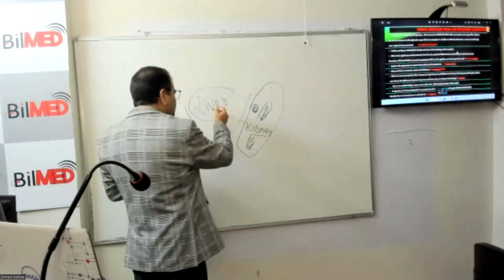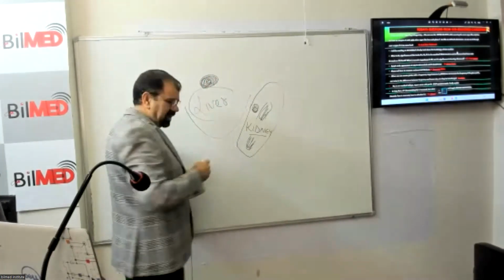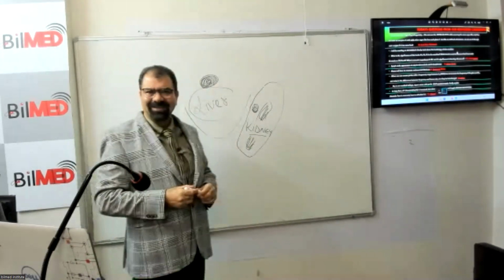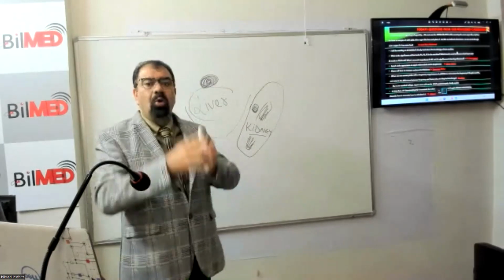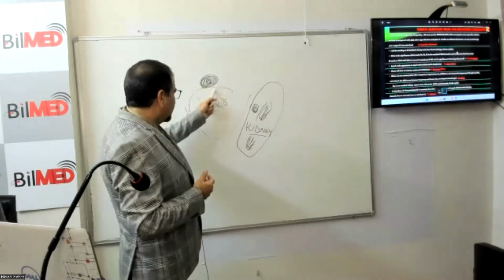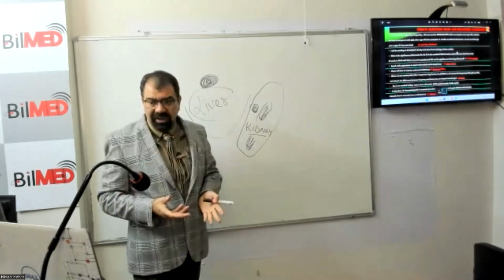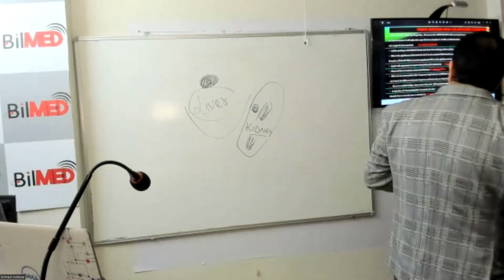Why? Because, for example, in the liver, there is a patch over there. This patch cannot be compared with the other organ. This patch I have to compare with the liver echogenicity. So when you ask what to compare with, if I have to compare the whole of the organ, then I have to use the other organ for comparison. But if I am defining the echogenicity of a patch, for example, in this case the liver, I have to use the echogenicity of the liver to say whether this patch is hyper or hypoechoic. So I hope that I have covered the first question from Dr. Alam.